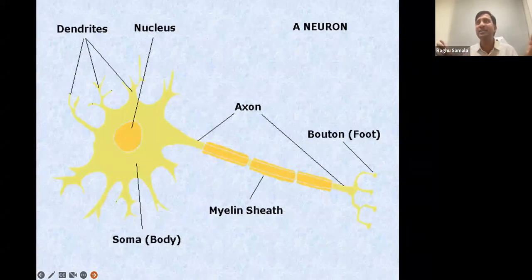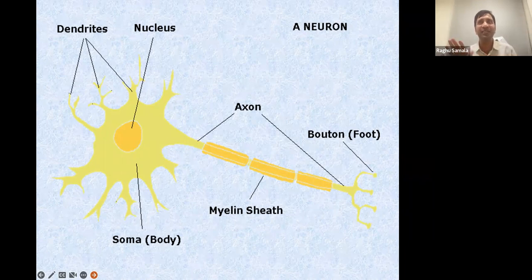The output coming from the EEG is only of two varieties: normal waves and abnormal waves. Normal waves we designate based on their number, and the other is spikes and sharp waves. But who generates these, and how do we record these waveforms? So who generates it?